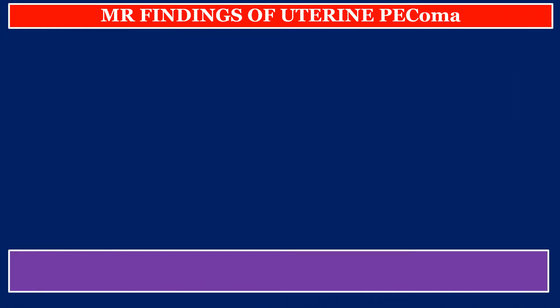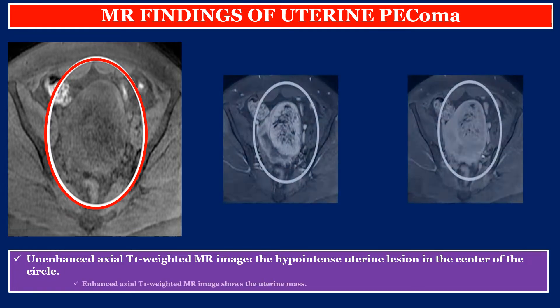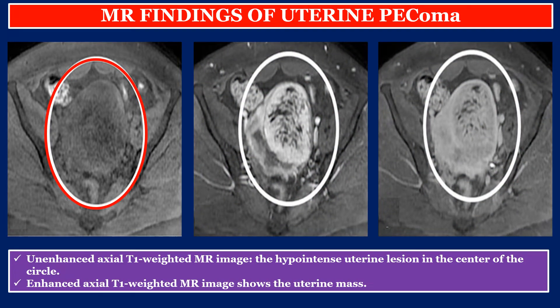MRI findings of uterine PEComa. This photo shows an unenhanced axial T1-weighted MR image with a hypo-intense uterine lesion in the center of the circle. These two photos show enhanced axial T1-weighted MR images showing the uterine mass.